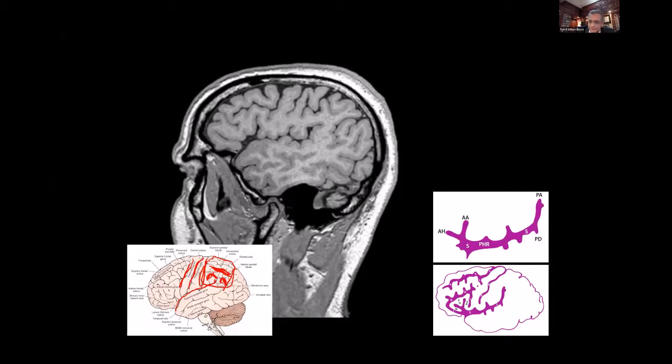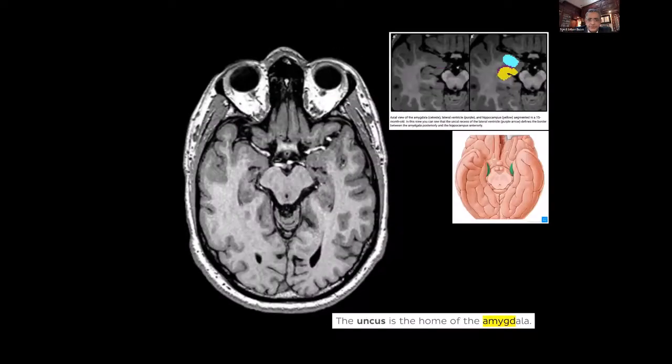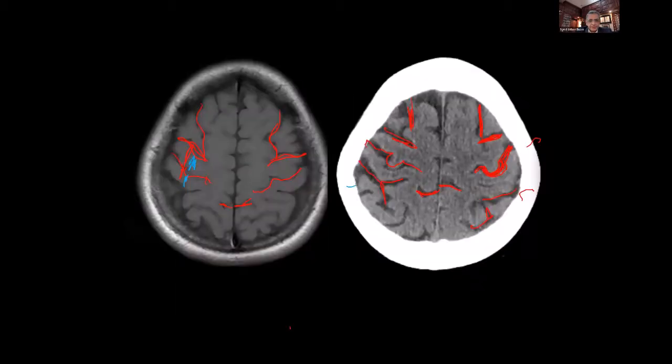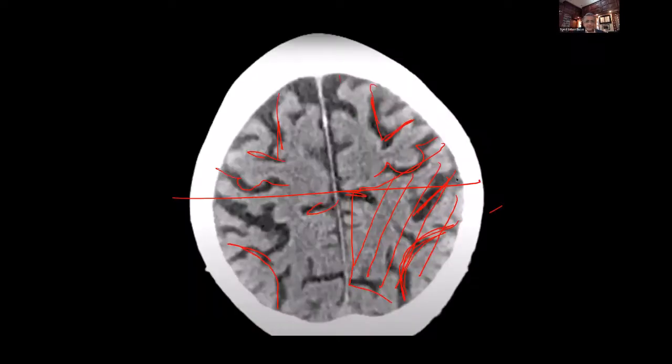Okay. So, coming back to that image that I was showing. So now you understand the intraparietal sulcus, right? This is the postcentral. So this whole thing is the parietal lobe. In CT scan, you see the parietal lobe and the frontal lobe, they're like this, right? It depends how you're positioned. But in MRI, for example, maybe this one here. In some MRI, you will see the frontal lobe coming all the way up to here because that's where it was positioned. Okay. All right.